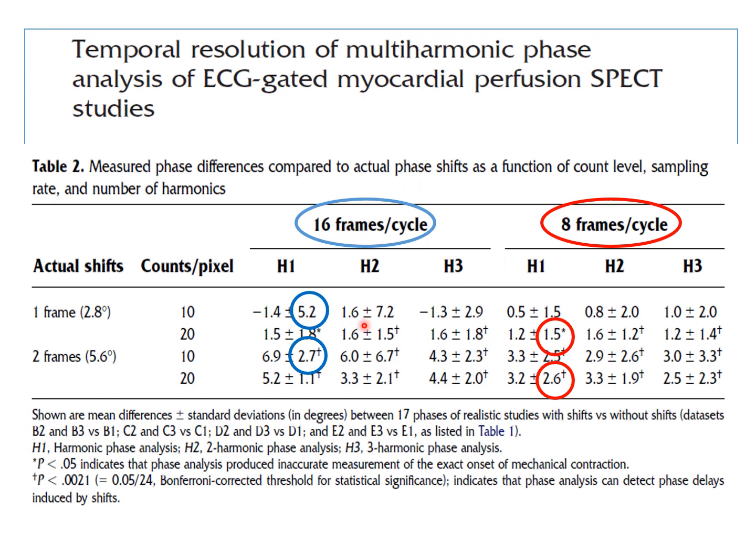16 frames. You can see that the standard deviation is dropped significantly, and in fact the change is significantly detected here. Excuse me, it's between here and here that we should be comparing, and even when it's twice that or 5.6 degrees, again roughly 16 milliseconds, then it's between 2.7 and 2.6, and now the two of them become significant.